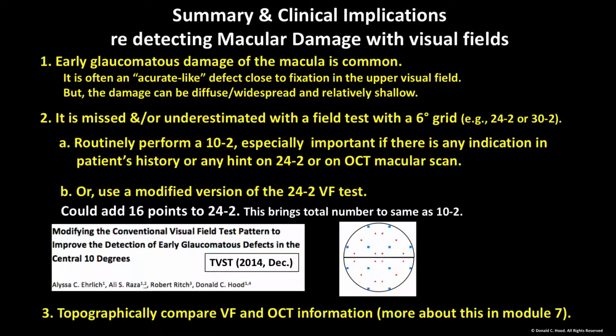All right, third, you want to topographically compare visual field and OCT information. And I'll say more about this in Module 7.